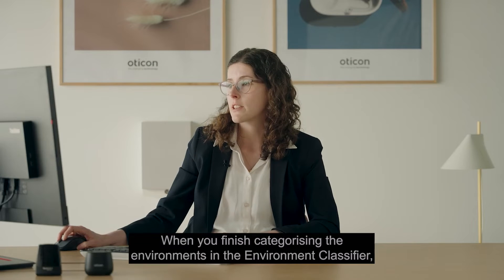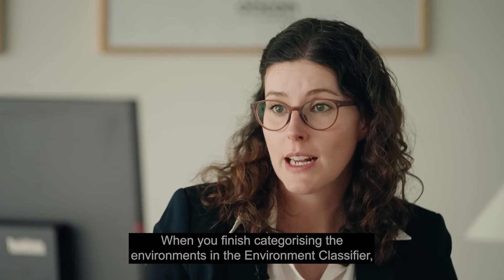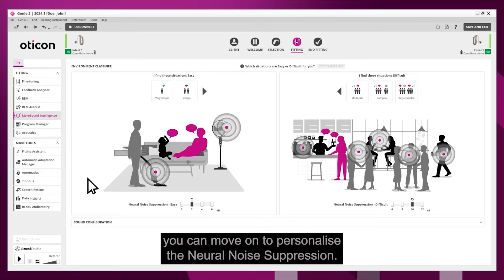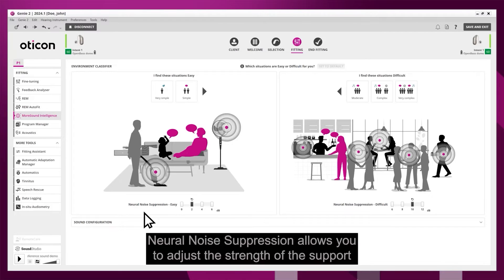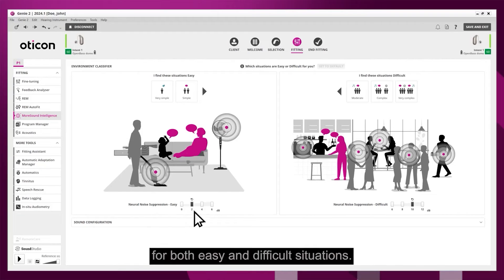When you've finished categorizing the environments in the environment classifier, you can move on to personalize the neural noise suppression. Neural noise suppression allows you to adjust the strength of the support provided by the deep neural network 2.0 for both easy and difficult situations.